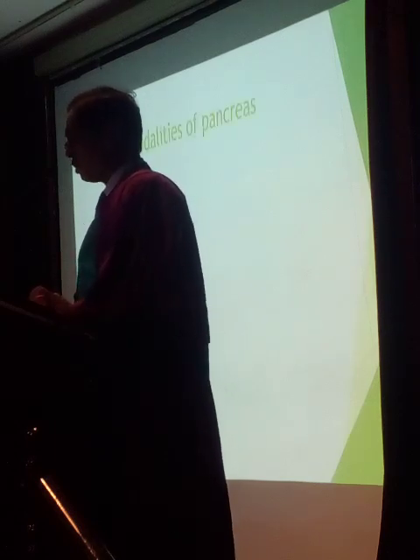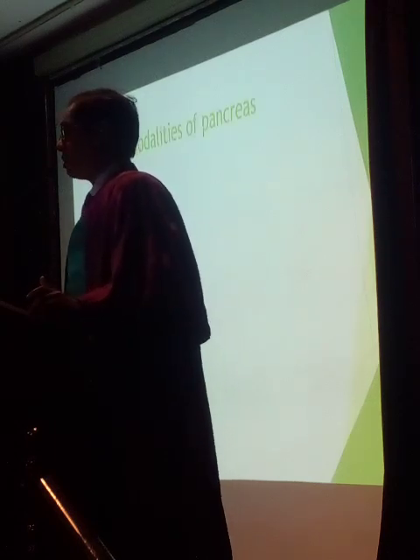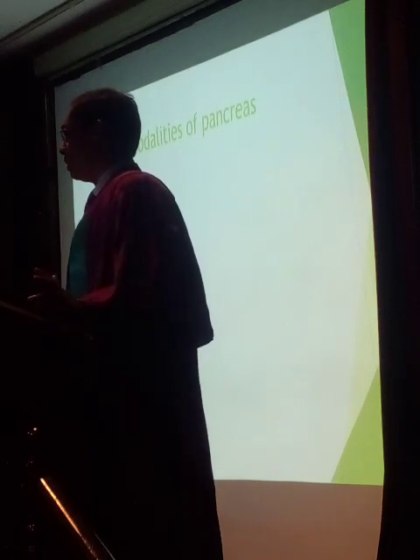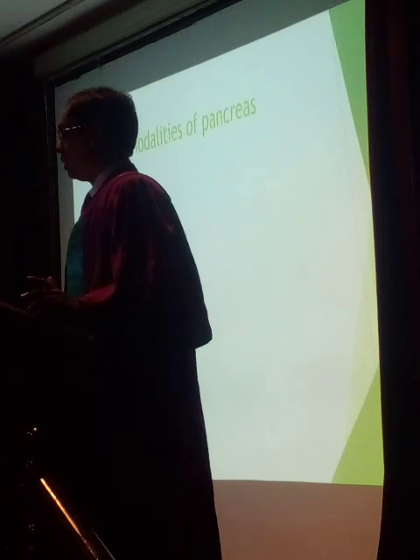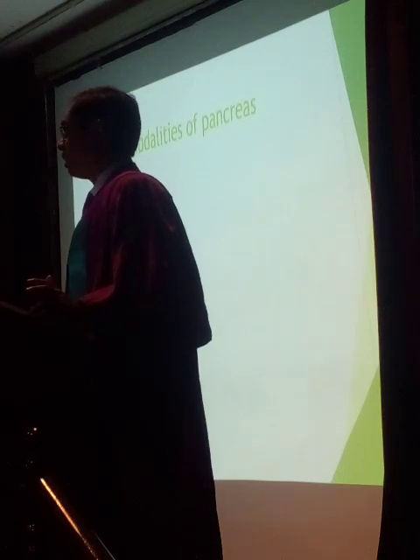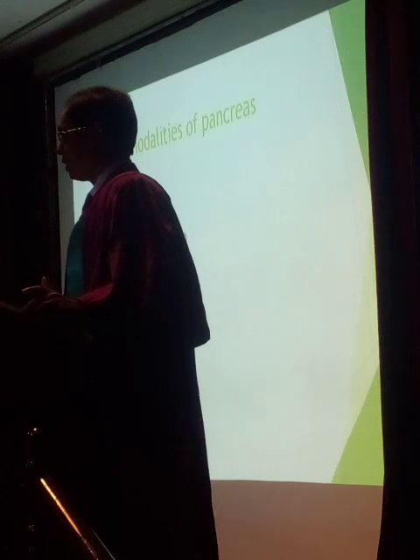So when we go straight to the radiological part, we can use all these modalities to image the pancreas. When we think about X-ray, a few tumors of the pancreas get calcified, so we can see those in X-rays.